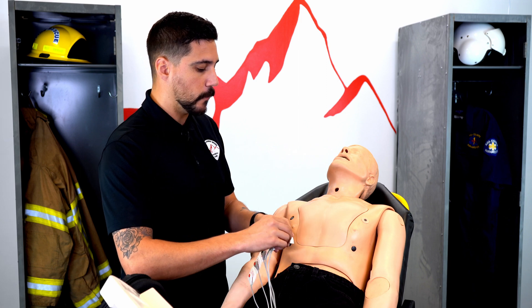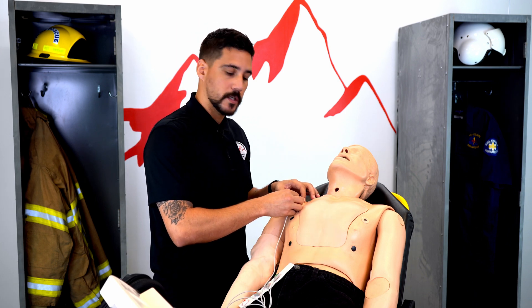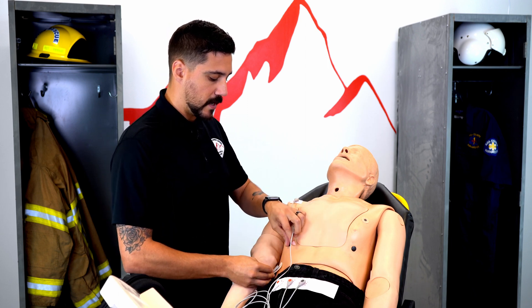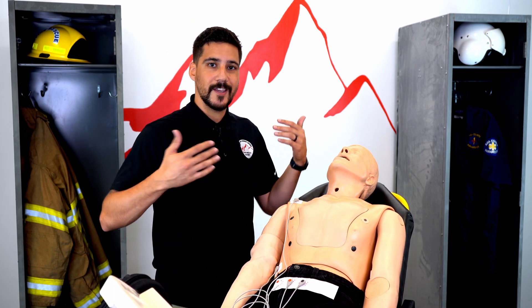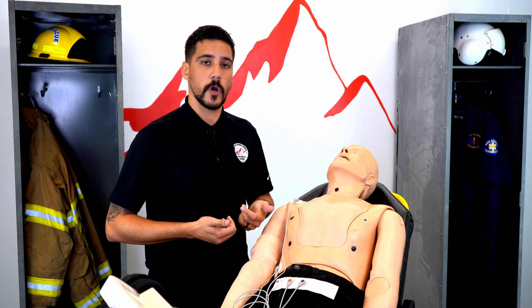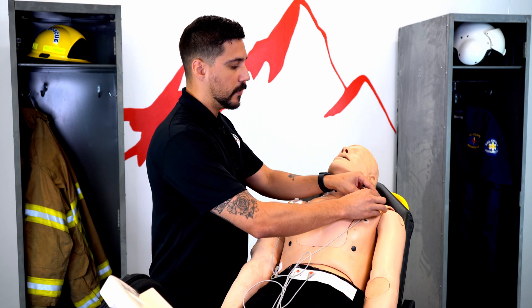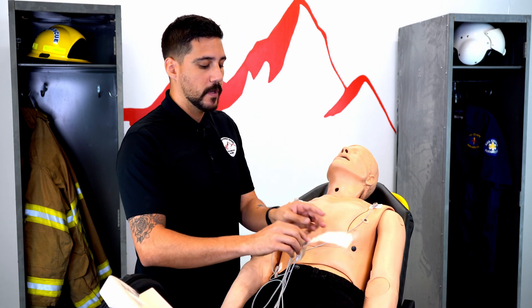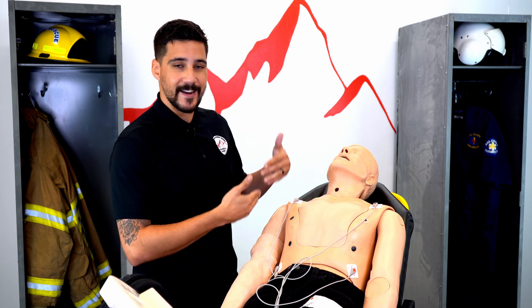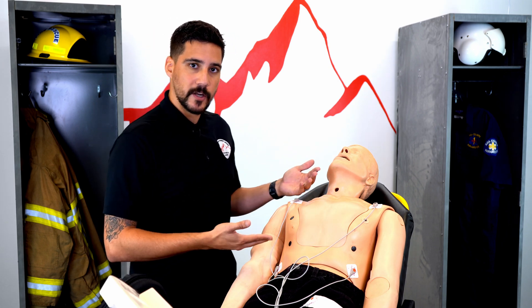Let's start with the 4-lead. The 4-lead is labeled right arm, right leg, left arm, left leg. An easy way to remember it is: white on right — the right arm will be our top corner. From there, white over green, clouds over grass. Note that I'm putting them on the trunk here. You can put them on the arms and legs, but as the patient or road moves, you can get artifact, so best practice is to put them on the torso. On the left side, the left arm is the black electrode, and the lower left leg is the red electrode — once again on the trunk. So clouds over grass, smoke over fire — that is the easiest way to remember how to do this. That is how we get our basic 4-lead.